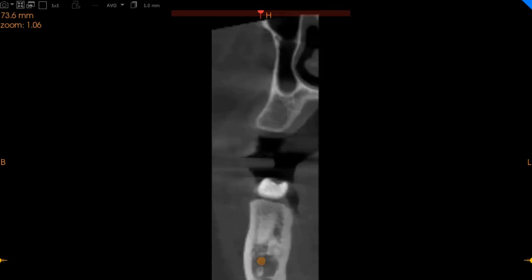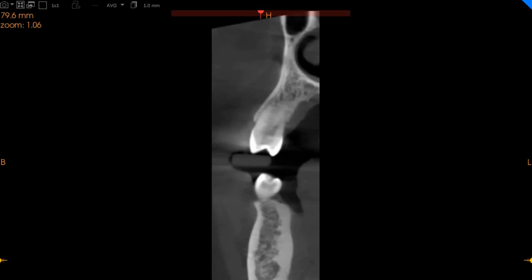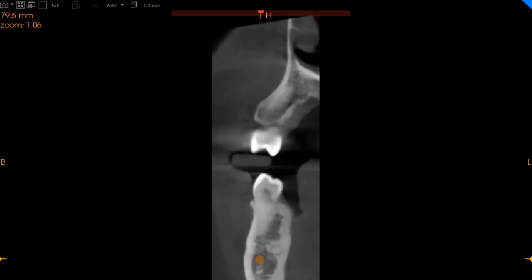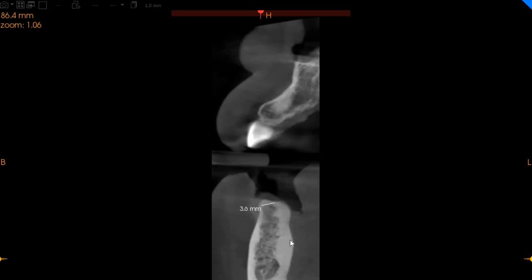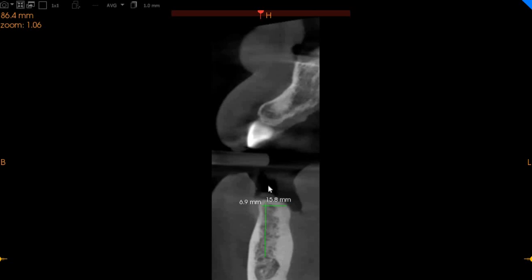Moving to the lower right first premolar region. Here we've got approximately seven millimeters of width with fifteen millimeters of height.